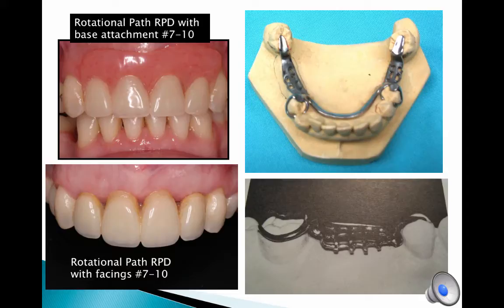This lecture gives you the principles of rotational path removable partial dentures, as well as defining their categories, advantages, and disadvantages. Hopefully, you will go out and practice and consider this as a means of replacement for these indications.